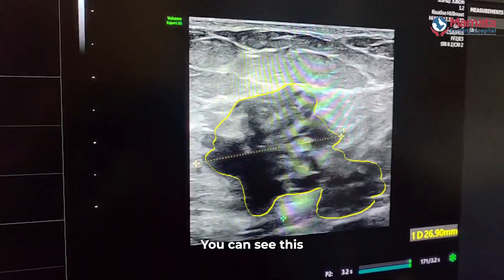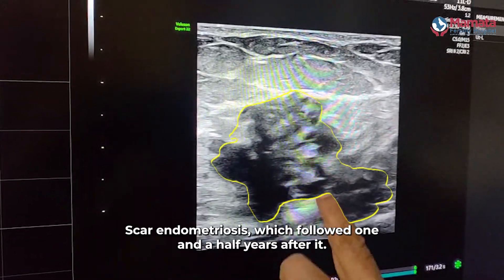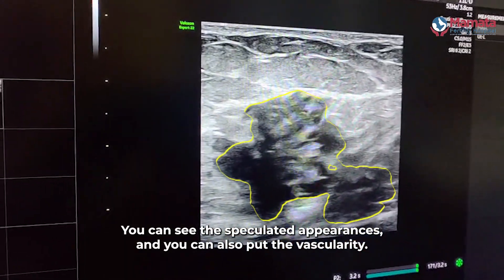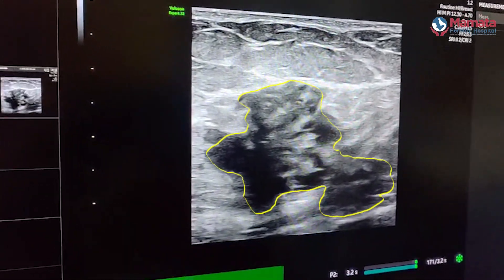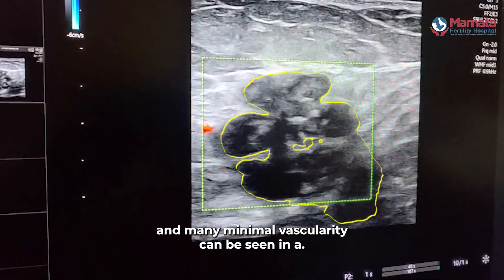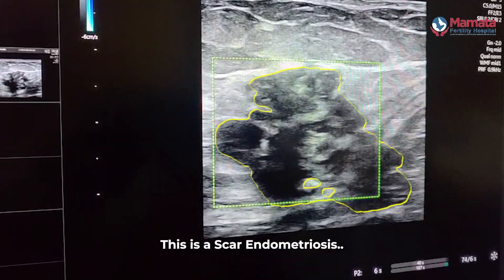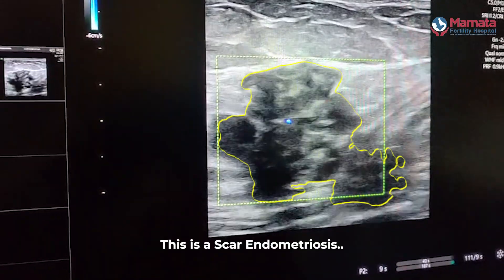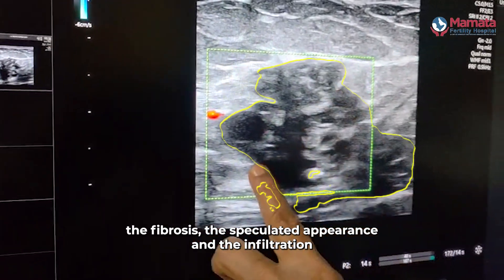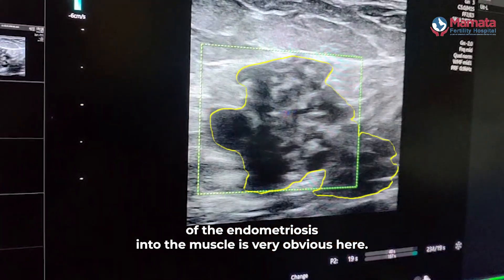You can see this scar endometriosis which followed one and a half years after a caesarean section. You can see the spiculated appearances and you can also assess the vascularity — the vascularity here is virtually nil. A very minimal vascularity can be seen in scar endometriosis; this is not a tumor, this is scar endometriosis. The spiculated appearance, the fibrosis, and the infiltration of the endometriosis into the muscle are very obvious here.